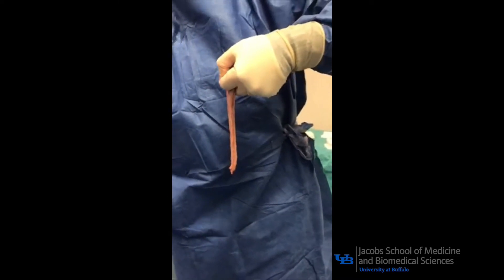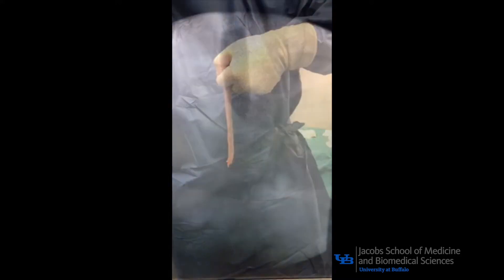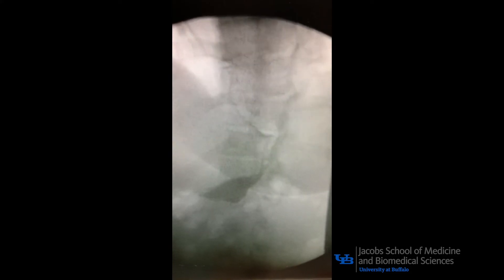There have been no intraoperative complications attributable to the use of this device. Routinely, patients tolerate bariatric clear liquids and protein shakes on the same day of surgery and are discharged on postoperative day one.